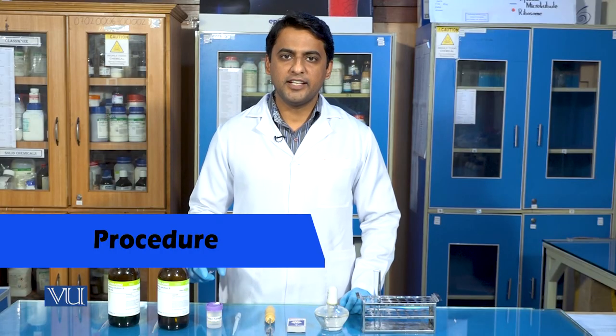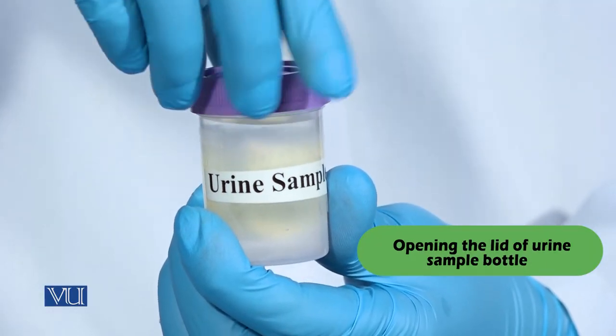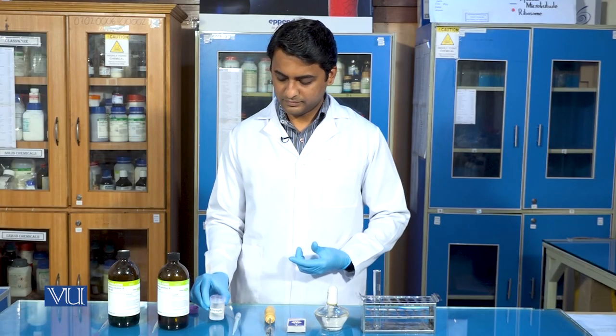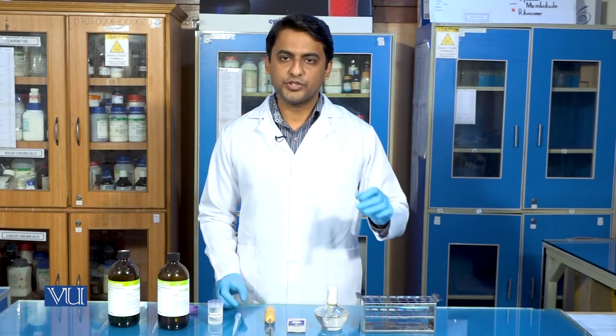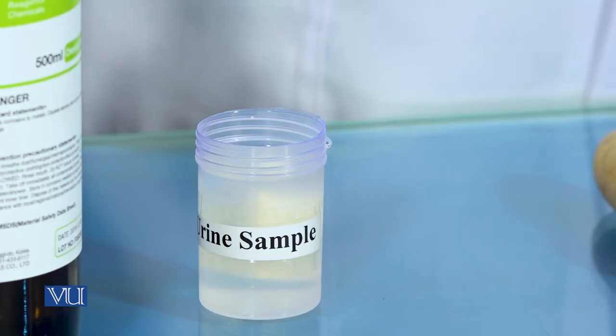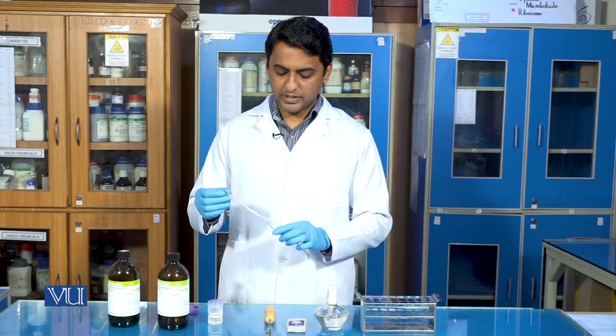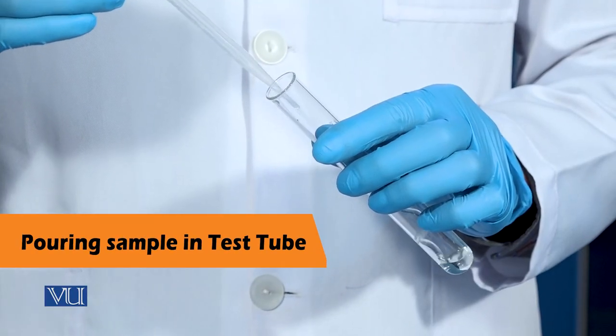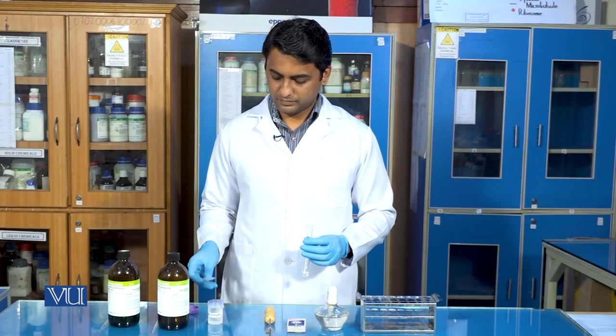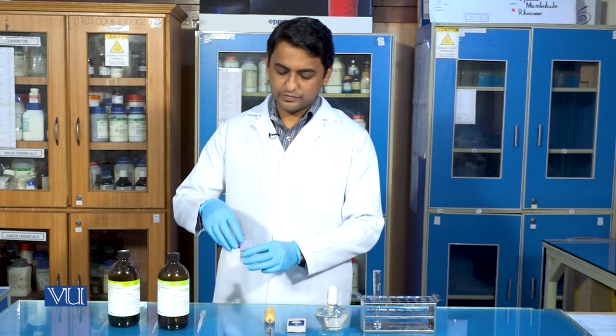In the very first step, we will take the urine sample container, carefully open the lid of urine sample. Then take a test tube. With the help of a dropper, take few drops from urine sample. Now pour urine sample into the test tube. Close the lid of urine sample bottle.